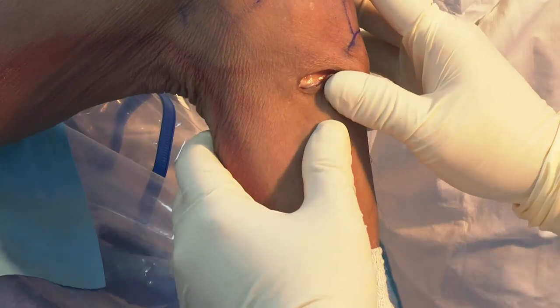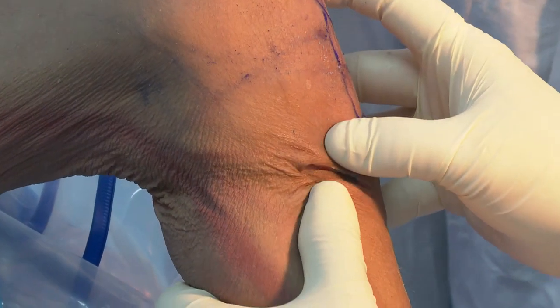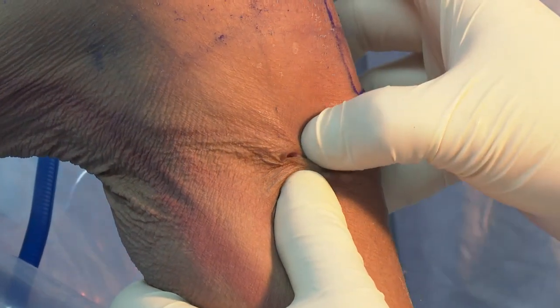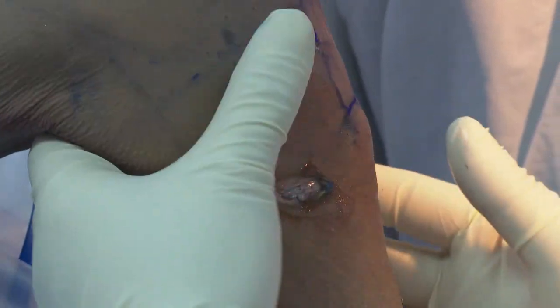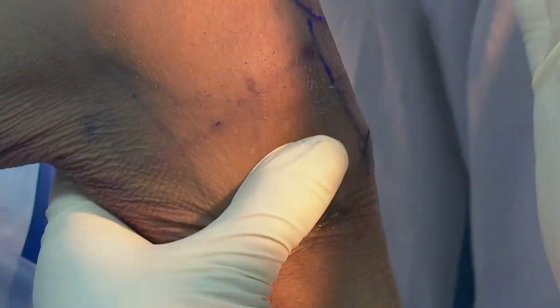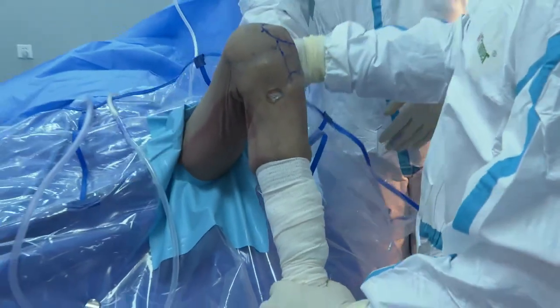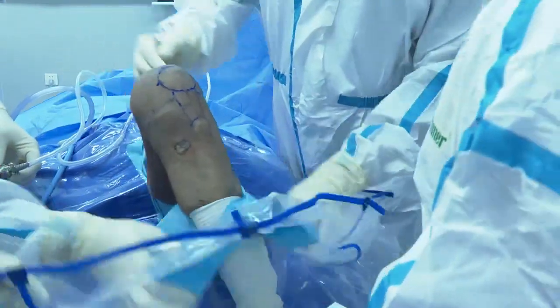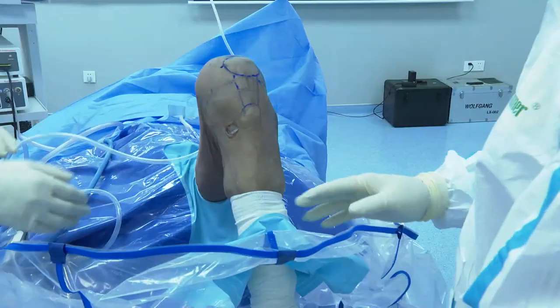Yeah, good. So you see that the incision is very small. Actually, we can make it smaller. But this is for the show, we make it bigger. But actually, the incision is like this. Only one. But my mentor, Dr. Sriyapok, he made it very small, 1 centimeter. Oh my God, very small. Yeah, but for me, I make it 2. Yeah, but my mentor can make it 1 centimeter. Unbelievable, okay? And you have no problem about nerve injury. Trust me, this technique. Okay? Today, for the surgical demonstration, I deliberately made it bigger. Usually 2 centimeters is enough for me, and my mentor can do it with 1 centimeter.